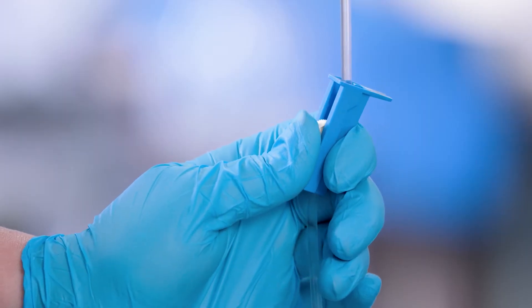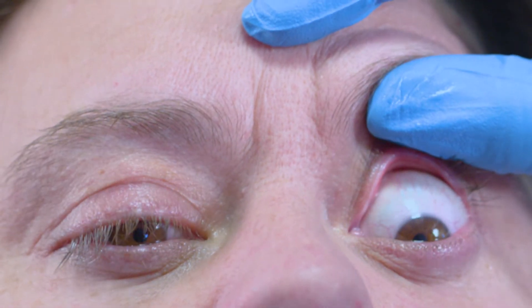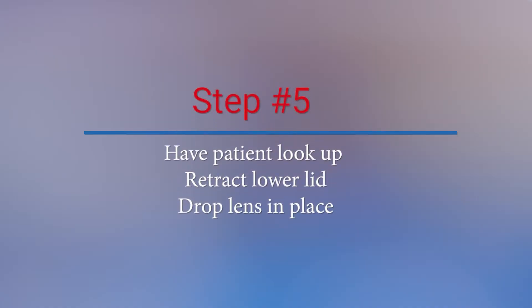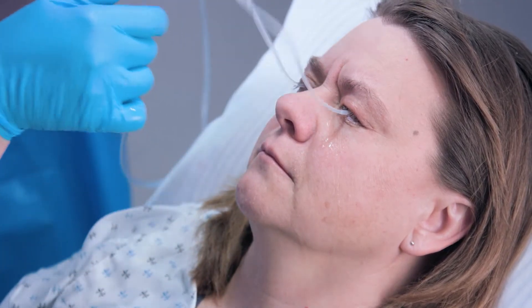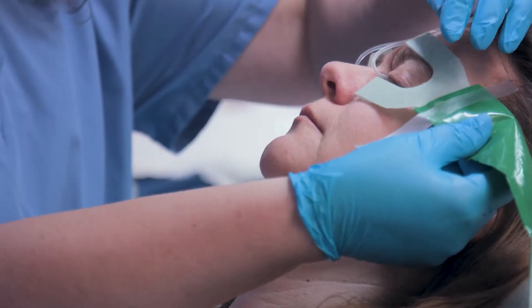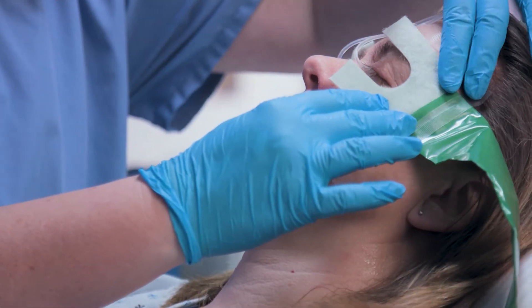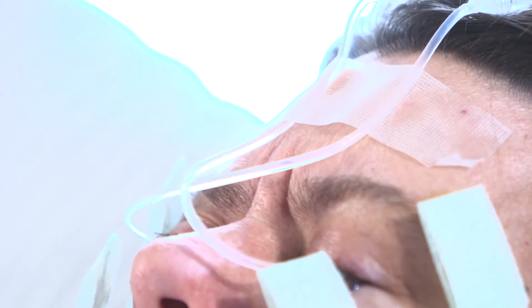Begin a minimal flow. To insert the lens, have your patient look down — this exposes the less sensitive sclera and protects the cornea. Insert the lens under the upper eyelid. Have the patient look up, retract the lower lid, and drop the lens in place. Adjust the flow to the desired rate and absorb the outflow with metaduct or towels. The metaduct conveniently wicks the fluid away from the patient and into a basin. To prevent accidental removal, the tubing may be taped to the patient's forehead.